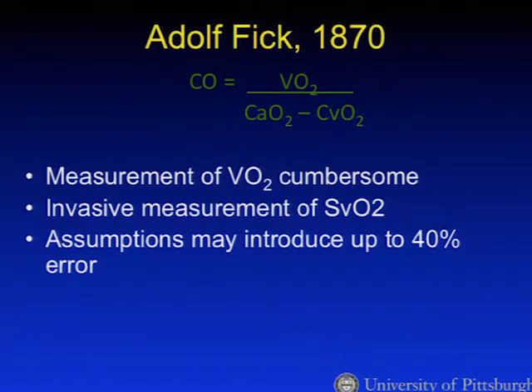The Fick principle applies to many of the indicator injection methods, such as dye dilution or pulmonary artery thermodilution methods. However, when the term Fick method is used, it really just refers to this algebraic determination of cardiac output.